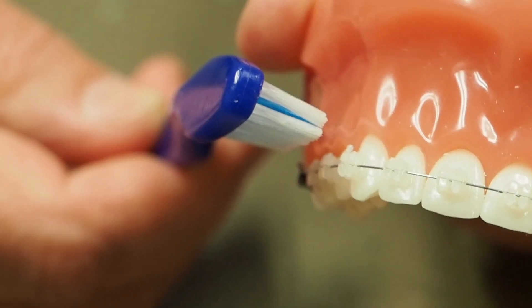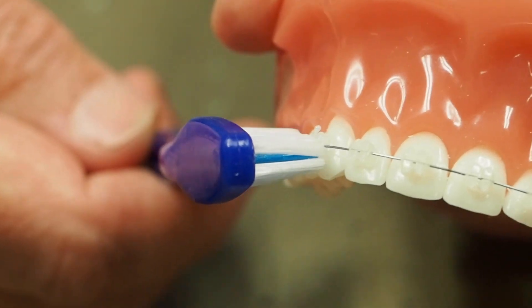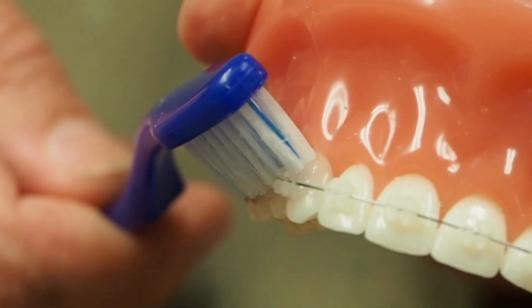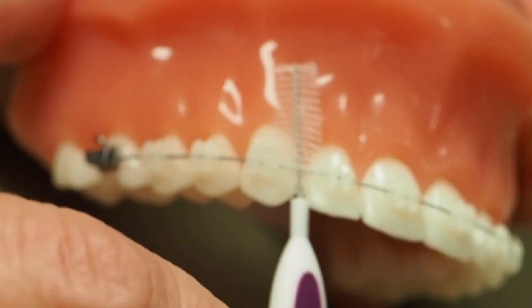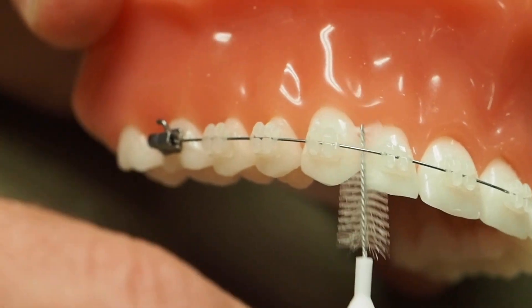It's almost like you have to brush your braces three times. You have to brush the bacteria off the front of the braces, the bottom of the braces, the top of the braces, and the sides of your braces. You can do this with the toothbrush and with the little bristle brush that we gave you, that you carefully slide under the wire.